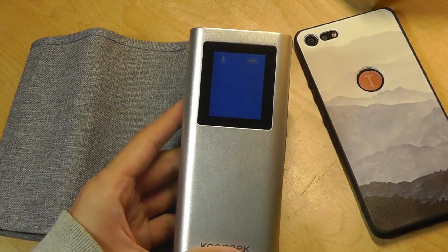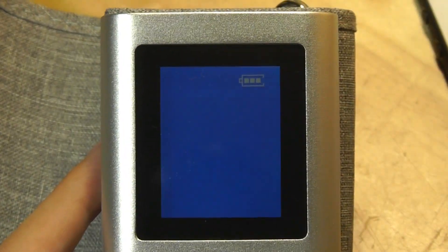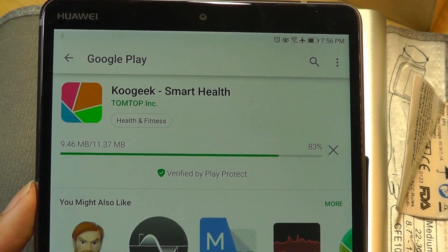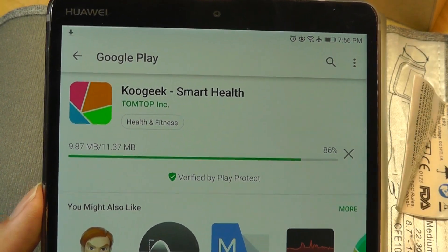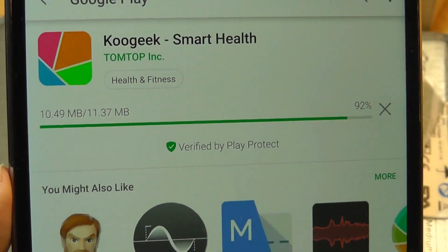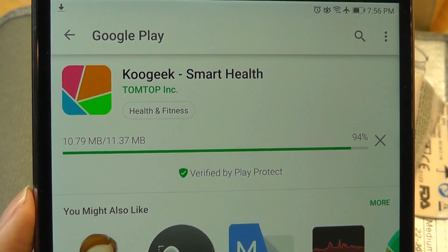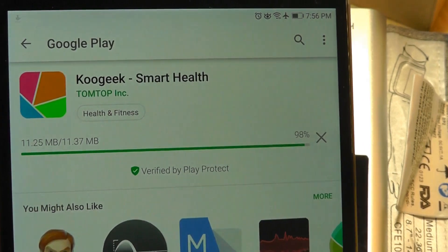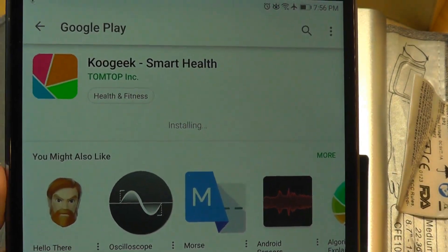Tapping on the switch once brings it to life, and by default it's trying to connect using Bluetooth to our phone first. The app, which is called Smart Health, can be found on the Play Store. Interestingly, it's actually made by TomTop, which is another online seller similar to GearBest, so this seems to be their own line of products — which is interesting because I found this one on Amazon.